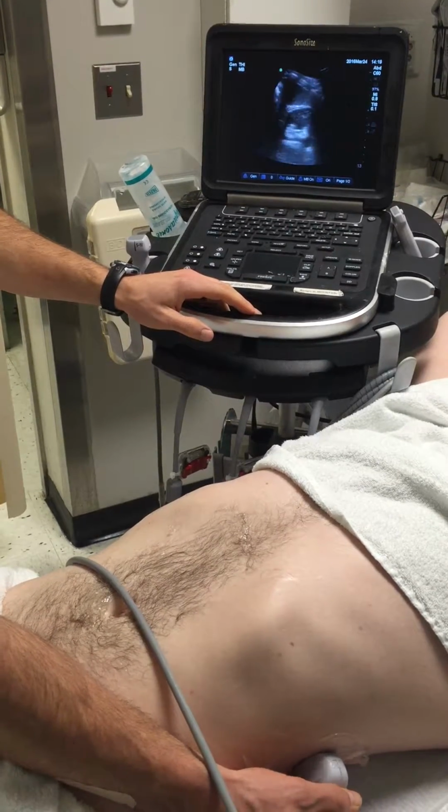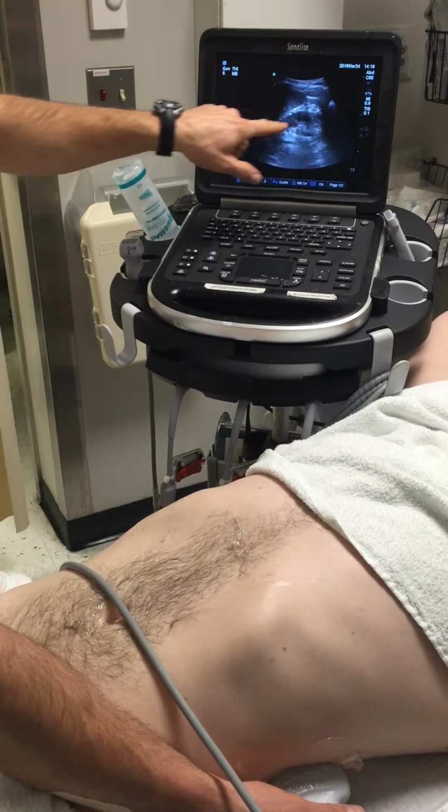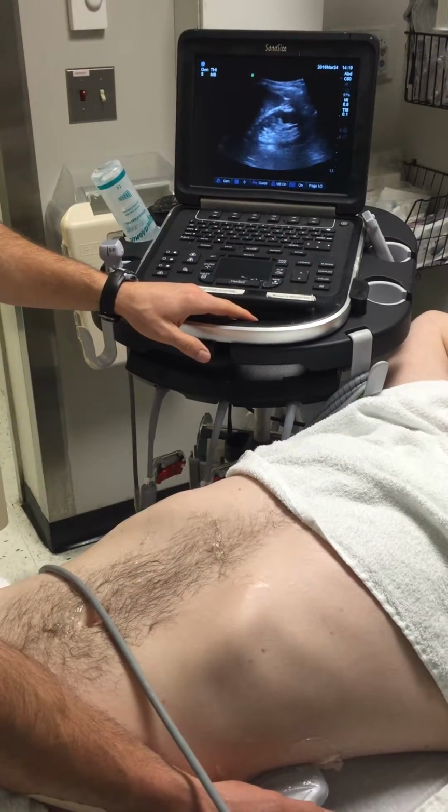For measurement purposes, if you're going to measure, you can measure in both views. You can measure a nice long axis here and short, depending on your clinical suspicion.